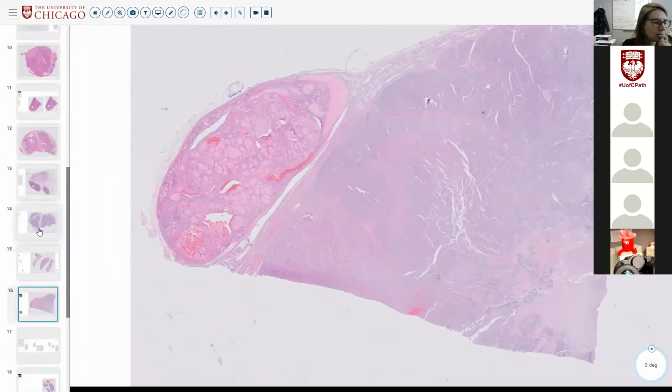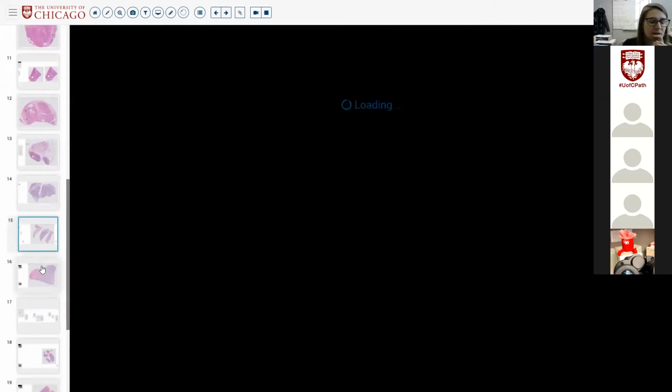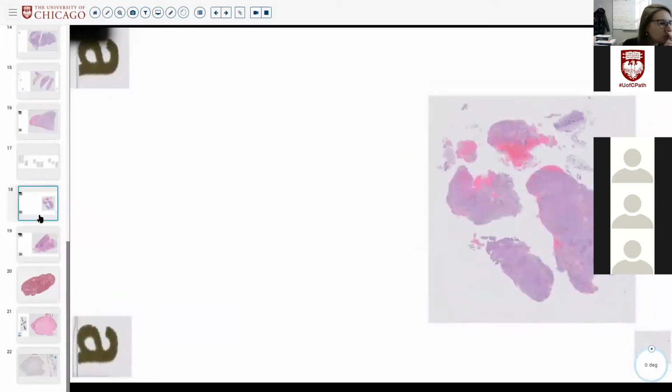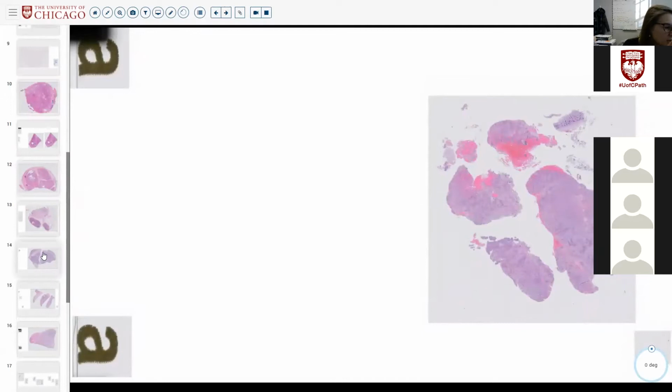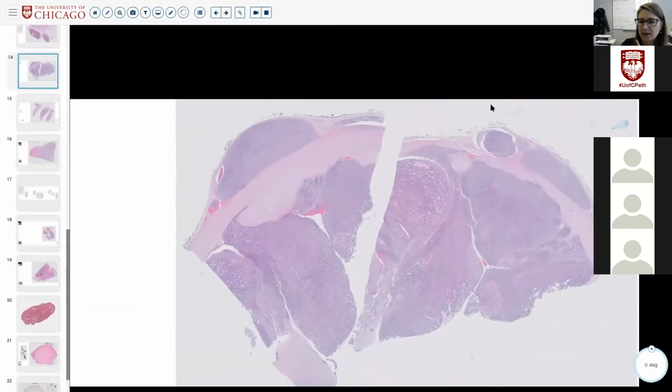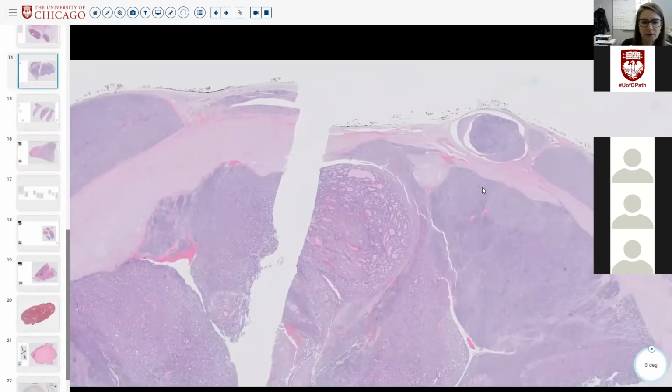We can pause and resume at another session in December. But while we're on the topic, I did want to show you one more thing just to confirm. Oh yeah, angioinvasion. So this was a slide that I wanted to show you angioinvasion on.